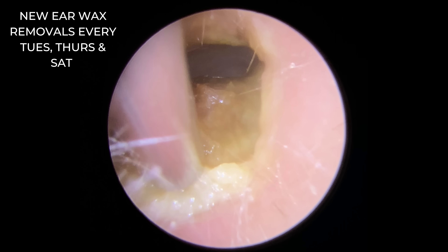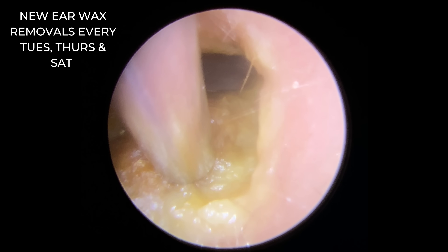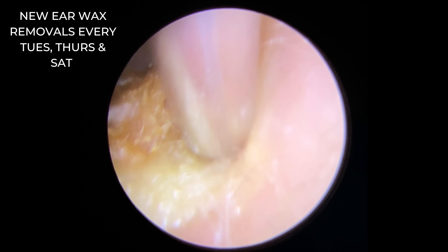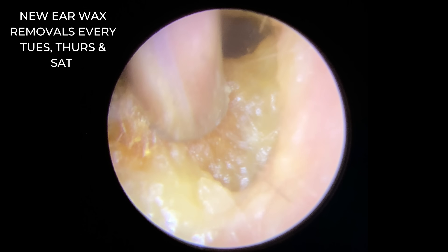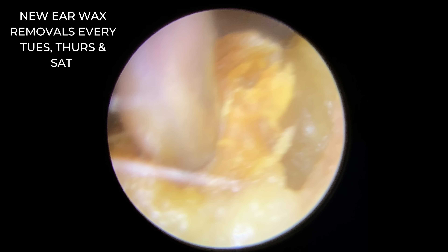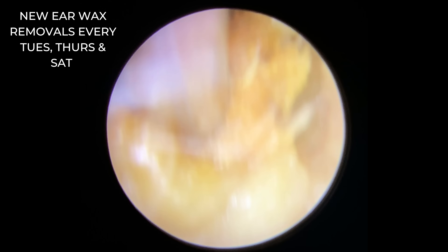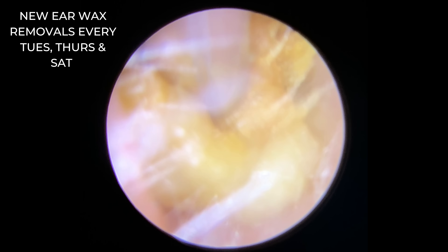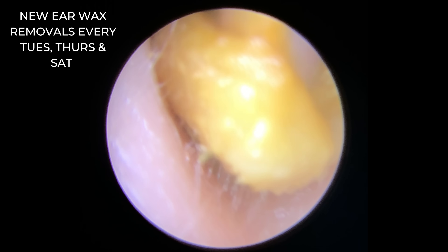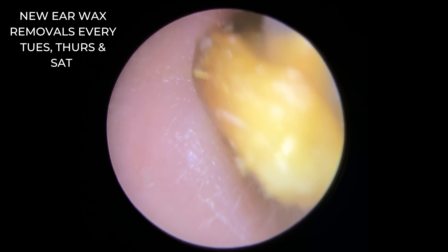This first patient here, you can see very, very soft wax. The patient has used a lot of oil — some wax softening drops like sodium bicarbonate, I would have said, because the wax has lightened in colour, which tends to happen with bicarb. We've managed to get a hold of this harder little nugget of wax in the middle, and it's just drawing all of this softer material out.